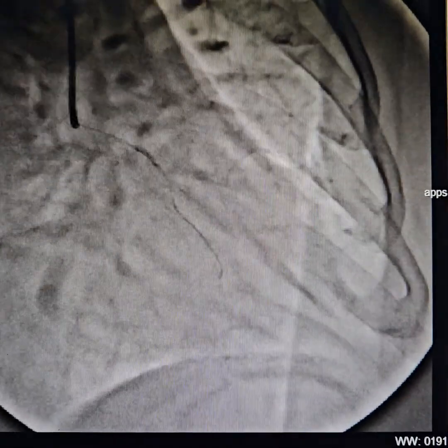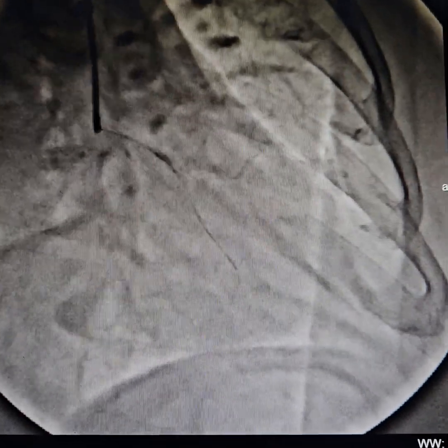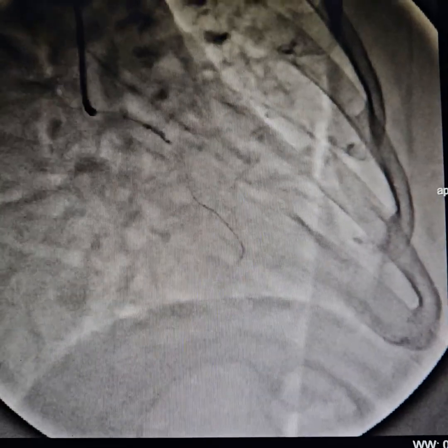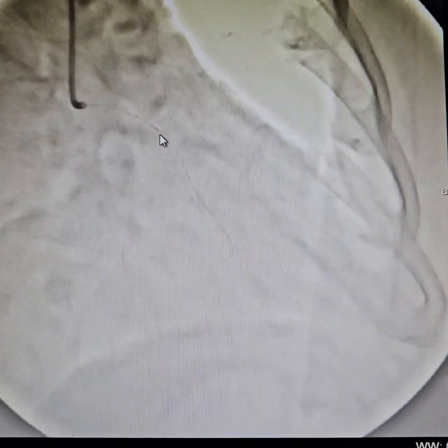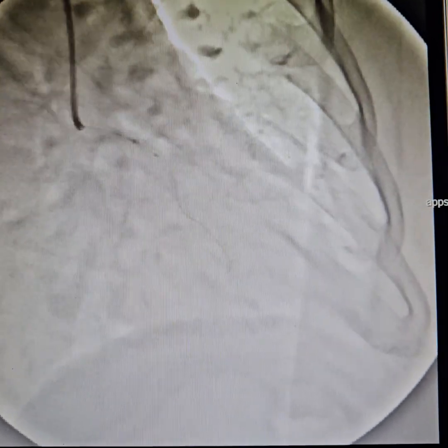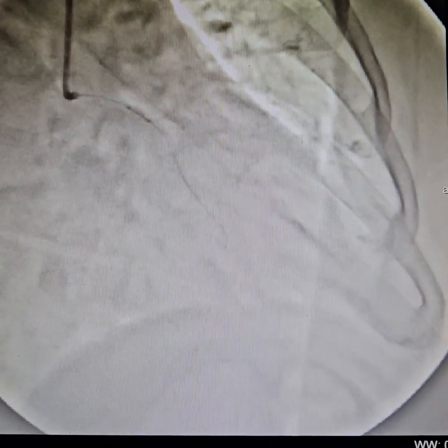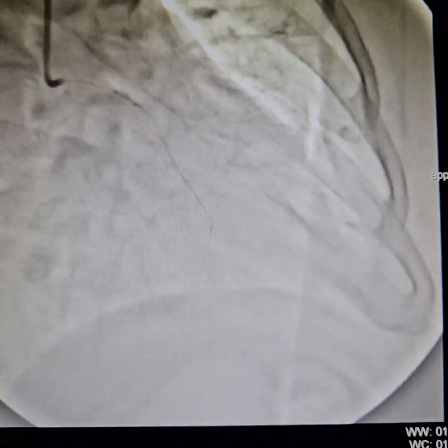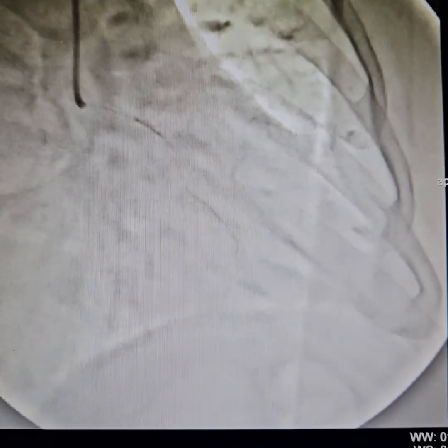Use liberal amounts of NTG when you're finished with your pre-dilation. We are pre-dilating above as well, using a semi-compliant balloon of 2 by 8 mm. You can see how important pre-dilation is. After adequate pre-dilation, we use nitroglycerin to vasodilate the artery and for proper sizing.